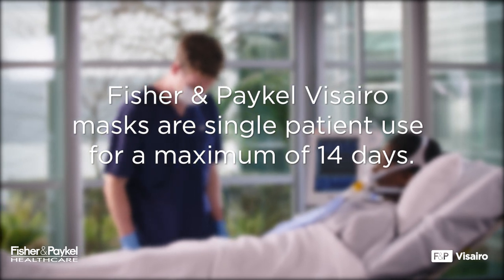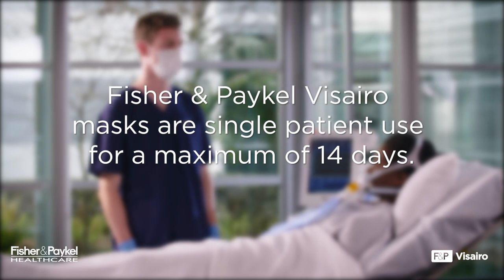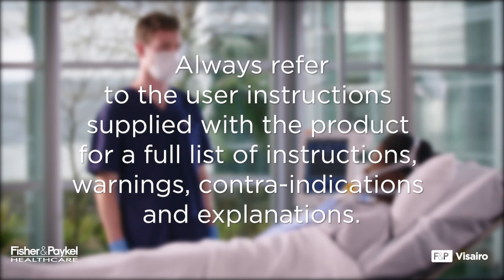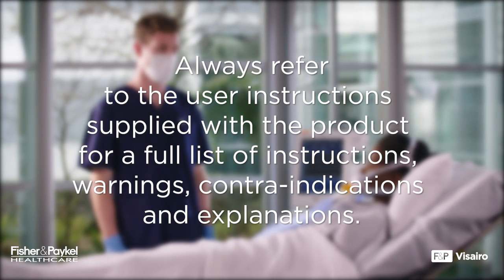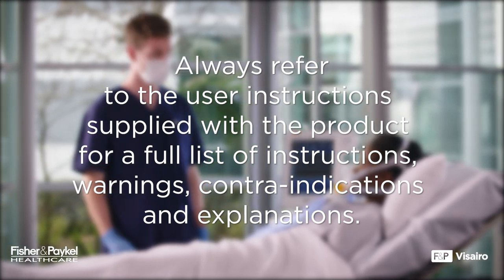Please note: Fisher & Paykel Vizzero Masks are single patient use for a maximum of 14 days. Always refer to the user instructions supplied with the product for a full list of instructions, warnings, contraindications, and explanations.